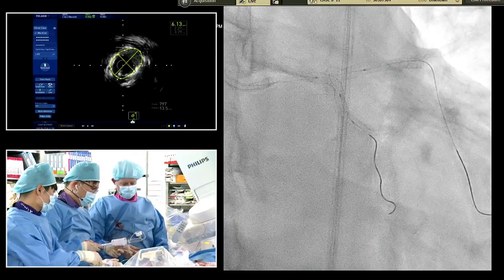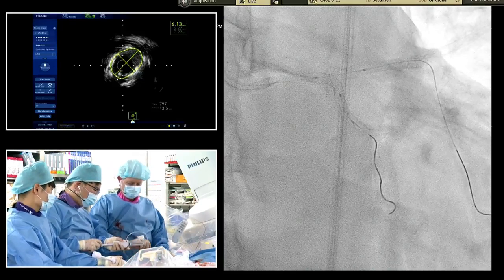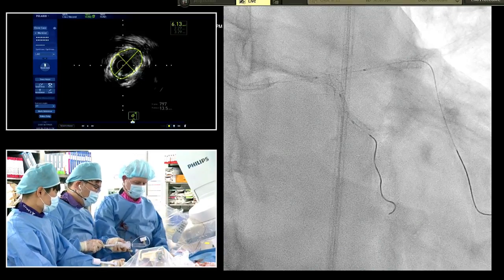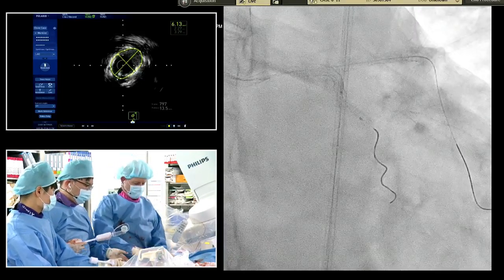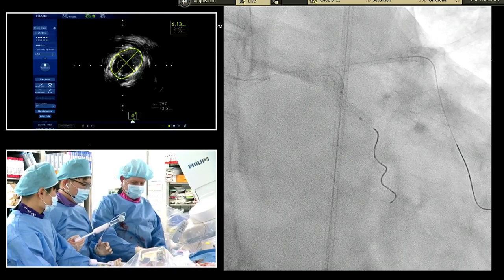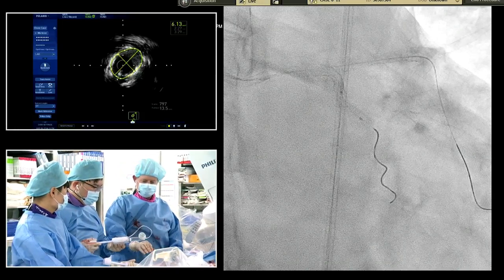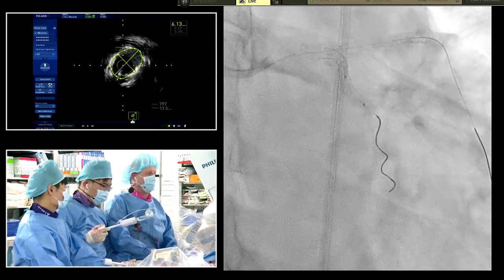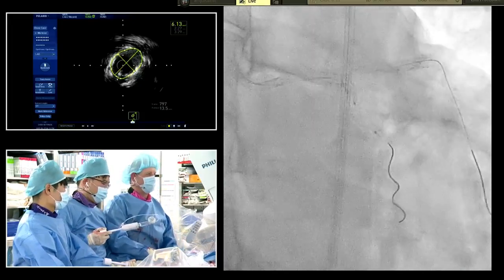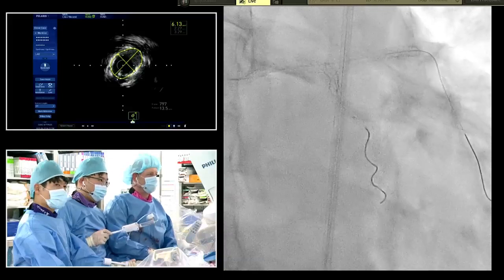Let's take the LAD balloon down. It is 3.5. Where's the LAD? This? TT LAD. Okay. In front? All right, let's take this out. Well, we just struggled to get it in, so. This is 3.5? Oh, this is 3.5? Yeah. Oh, sorry. I thought you were anchoring with the 2.0. I just pulled out the balloon we wanted to use.